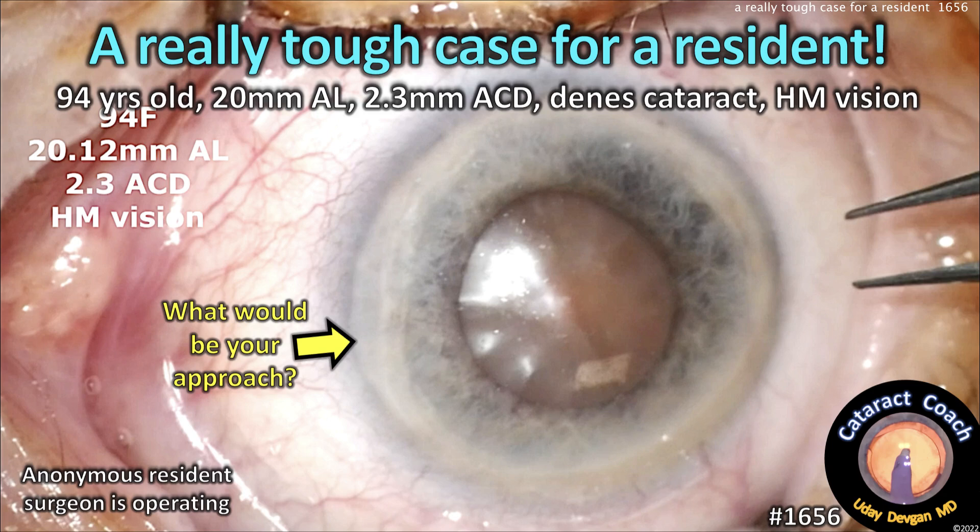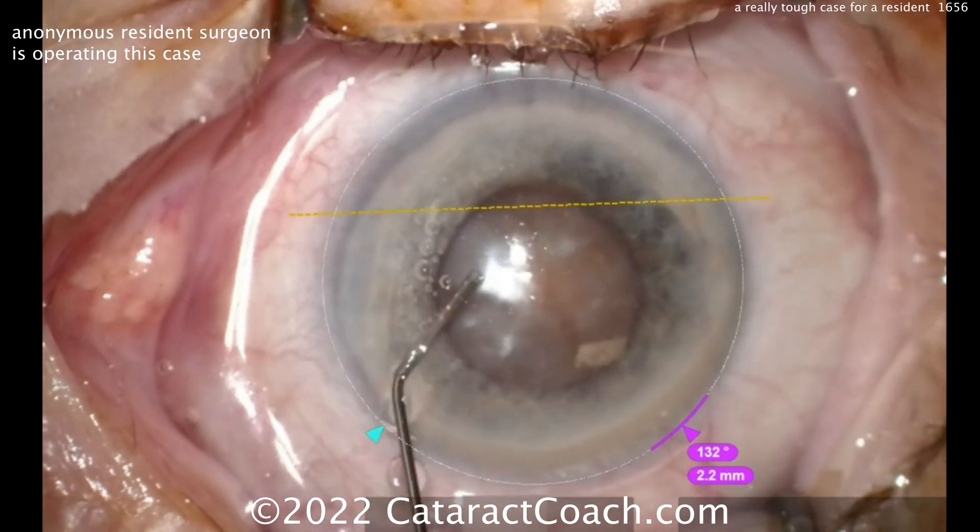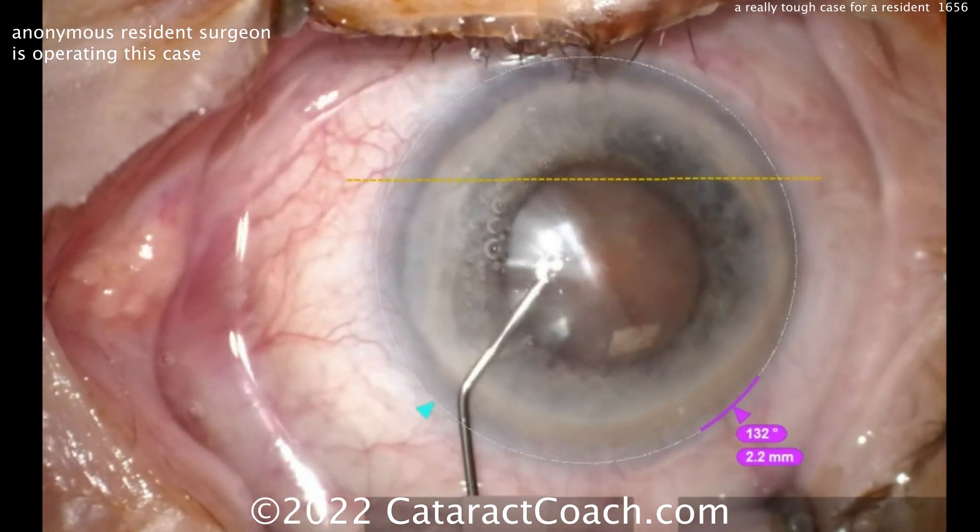CataractCoach.com — a really tough case for a resident. 94-year-old patient, 20-millimeter axial length, 2-millimeter shallow anterior chamber, dense cataract, hand motion vision. Yikes.